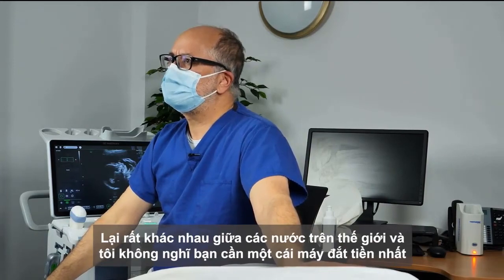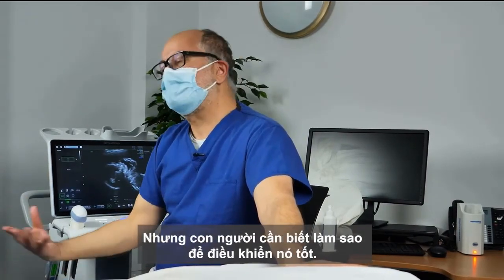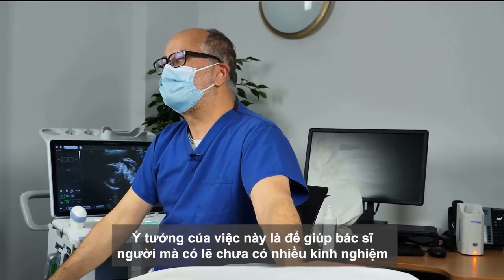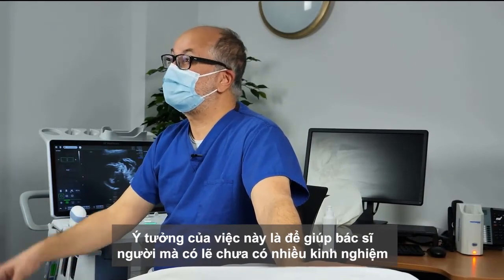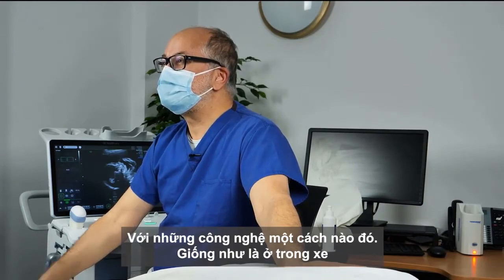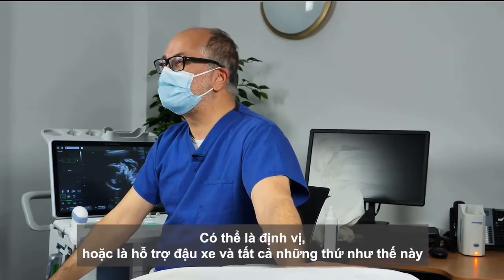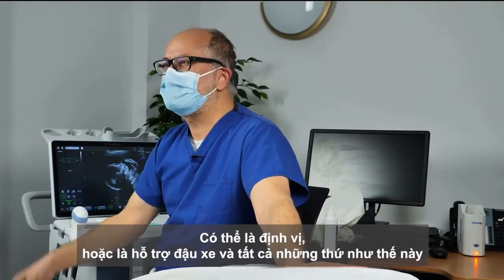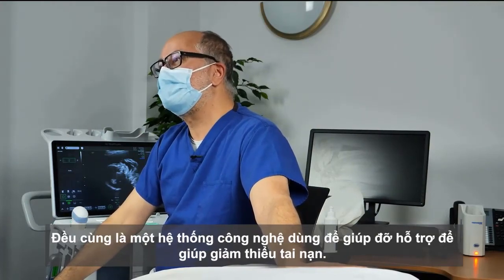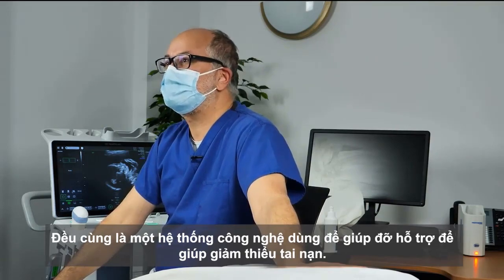And I don't think you need the most expensive machines necessarily, but the people need to know how to drive them really well. And the idea of this is to help people who perhaps are still not the most experienced drivers with some technology, in the same way that you do in your car. You've got systems that help you, right? Whether it be your satellite navigation or your lane assist and all these things. It's kind of in the same vein of assistive technologies that will hopefully make accidents less likely.